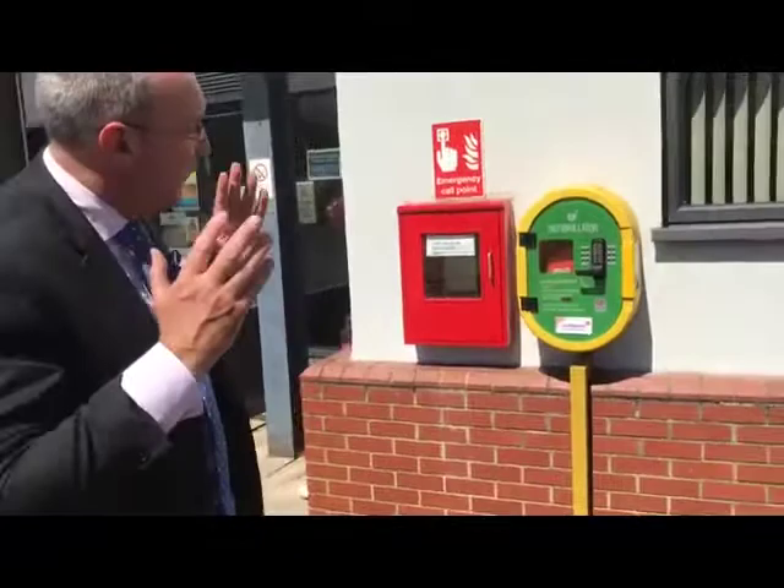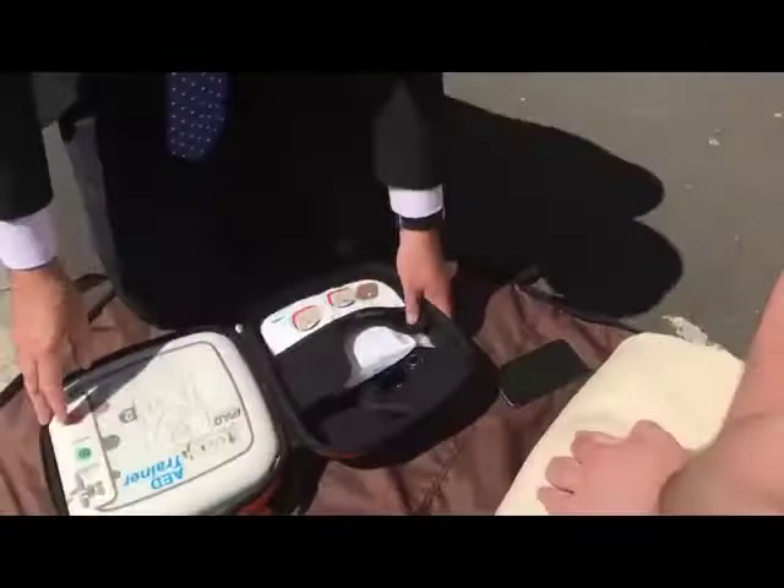The ambulance service told us there's a defibrillator at the fire station just around the corner. They've given us the code, so I'm going to go and get the defibrillator from the fire station.